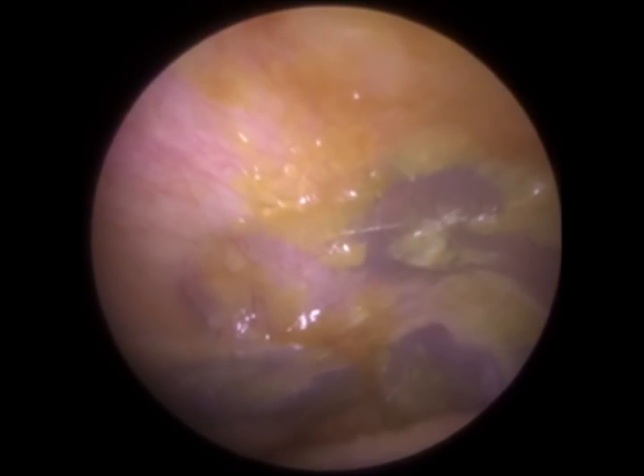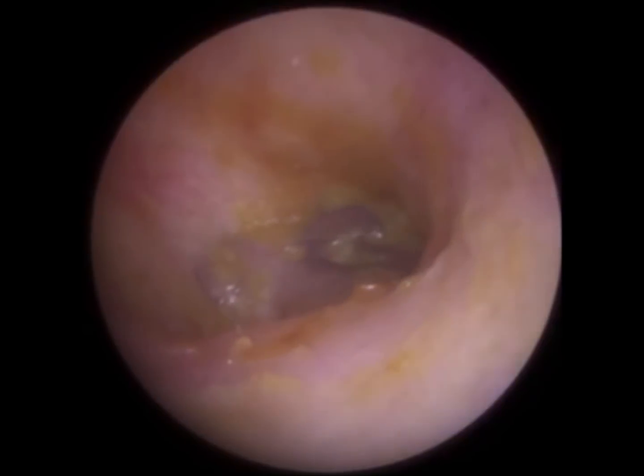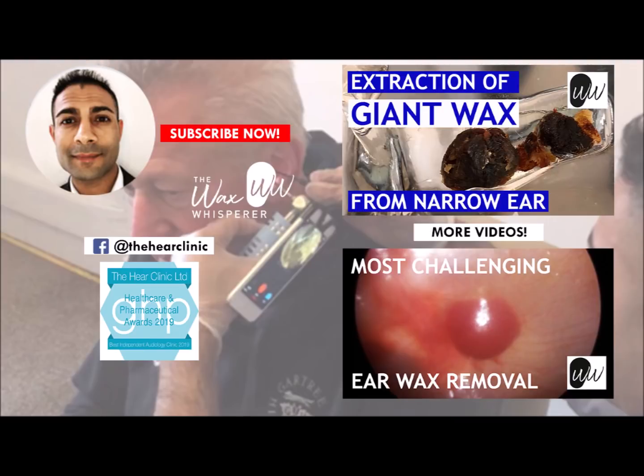You can see the view that we got. It's just an amazing view with an endoscope. And that's it. The handle of malleus, so the hammer bone, is fully visible now. Eardrum's clear enough.